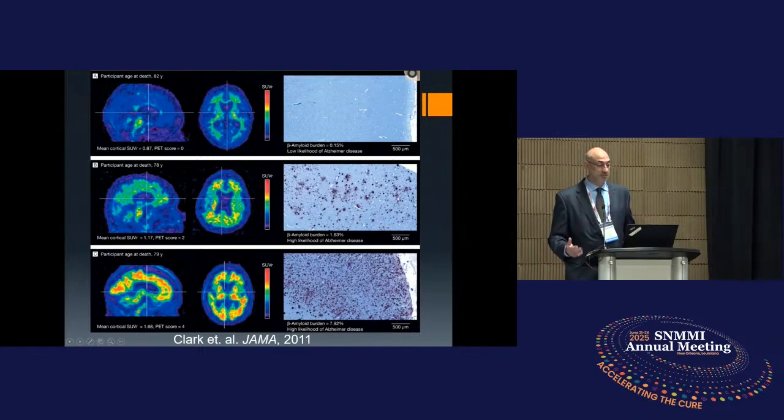Well, we had a group, this paper was almost 15 years old now, two groups of 30 patients. One where they clinically had a diagnosis of Alzheimer's disease by an expert, a neurologist, a geriatric psychiatrist who could diagnose them. The other was a group of patients who had some type of end-stage disease, that is a disease that they could not survive from, so maybe heart failure and they couldn't get a transplant, or there's a number of them out there. Basically they agreed to have a PET scan and then generously and thoughtfully agreed to donate their brains for the pathology study.